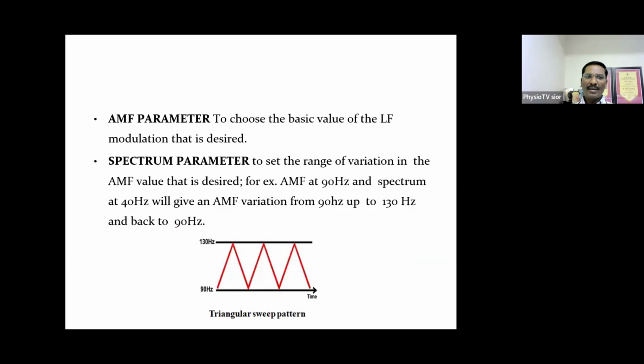Now, the next parameter is the AMF parameter. To choose the basic value, low frequency modulation is desired. Here, the expected low frequency which is useful for treatment can be set by using the AMF parameter.